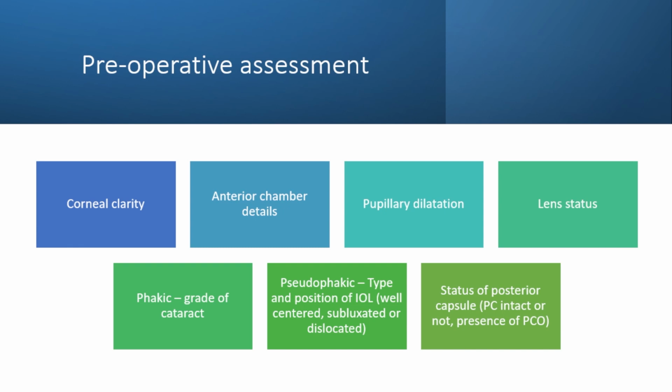The second thing is, when you said phakic, it's important to realize it's not the grade of cataract, it's a very loose term. It's the location of the lens opacity which is more important. With nuclear sclerosis, even 3+, you can actually do a very good vitrectomy with the light pipe inside the eye, as long as there are no posterior capsular changes and cortical opacities. But one thin posterior subcapsular opacity is enough to cause maximum interference with your surgery, although the rest of the nucleus is clear. So what is important is the location of the opacity.